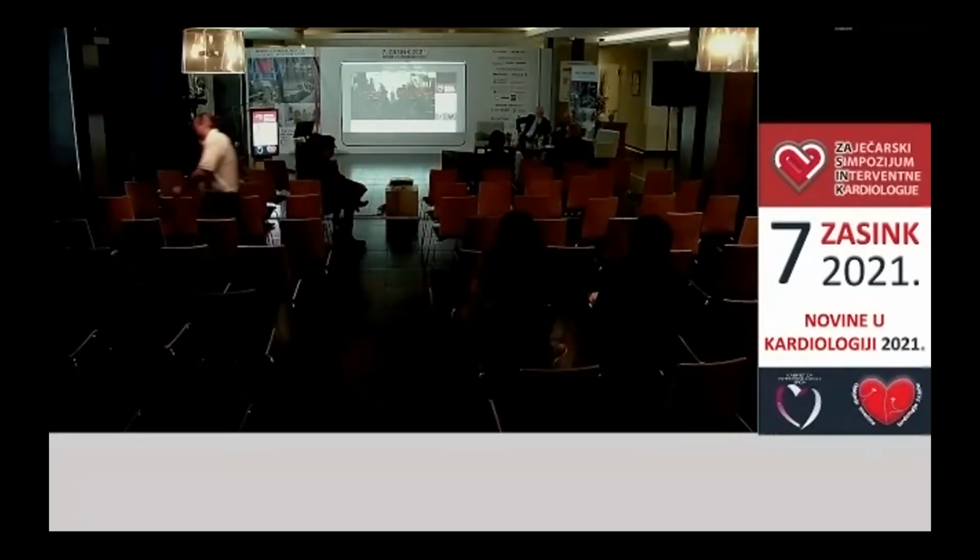No, I'm joking. Well, I heard a similar presentation from Vasilev two years ago, during the European Bifurcation Club meeting. He presented his data about the intracoronary ECG registration. I remember that Patrick Sirius said that this is a fantastic method, a very cheap method to evaluate the procedure, bifurcation or not bifurcation, during the angioplasty, to see your result and to reduce the use of the contrast. Very cheap method, very easy to perform.